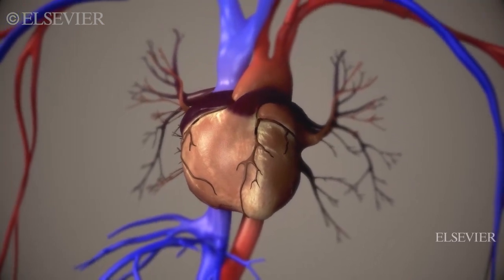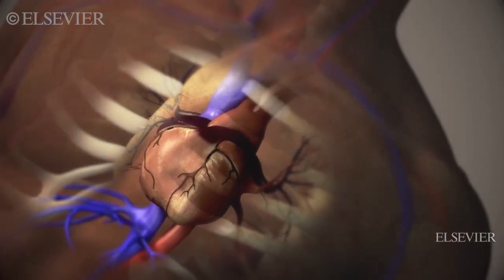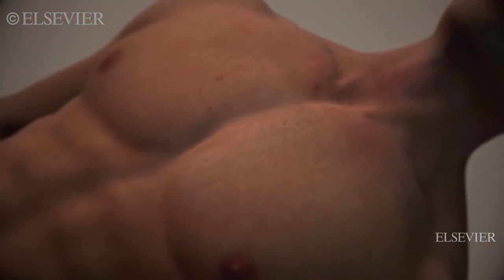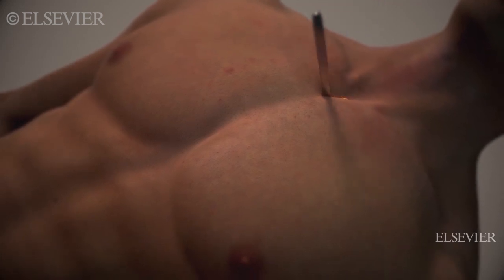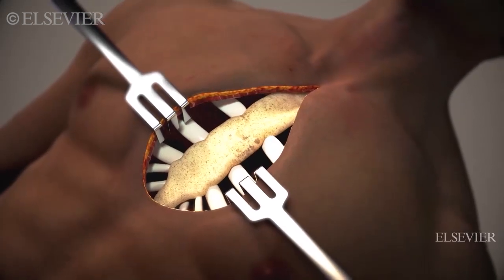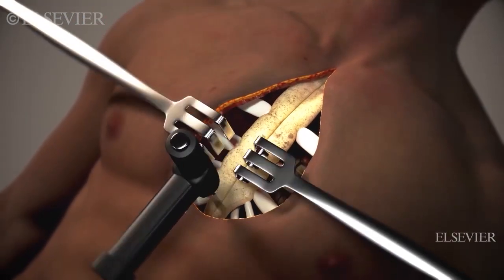To improve blood flow to the heart, a patient may have a coronary artery bypass graft, or CABG, of the blocked arteries. In the traditional open-heart form of the surgery, a 6 to 8 inch incision is made in the middle of the chest. Then the sternum is cut through and the rib cage is moved to examine the heart.